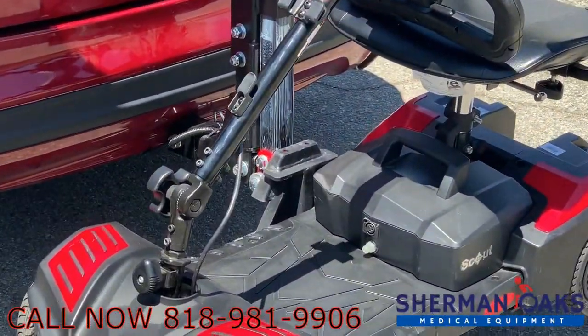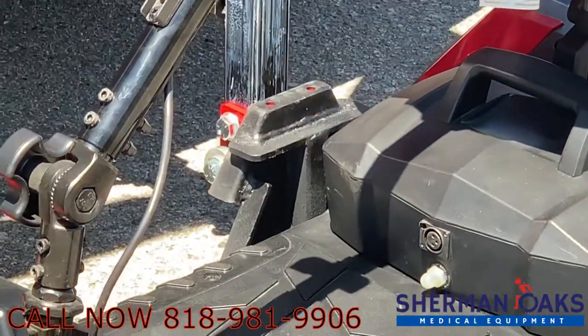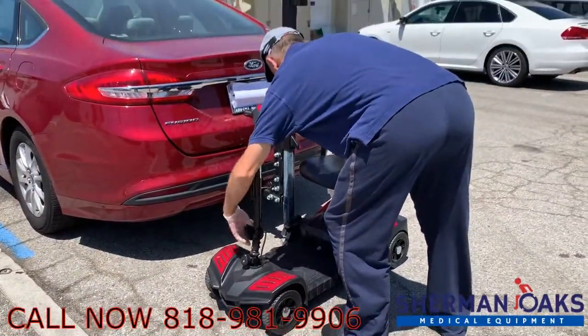The lift itself comes in three different sizes that will vary depending on the scooter you're lifting and the vehicle you have. The use of the scooter is very easy as it is just an up and a down button and all you need to do is drive the scooter parallel.